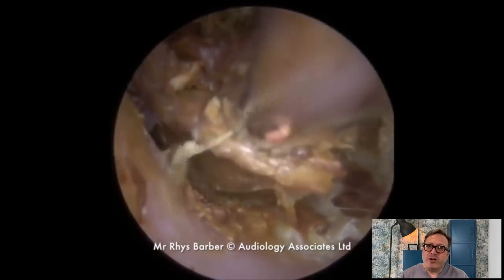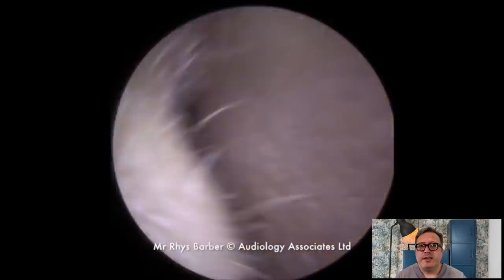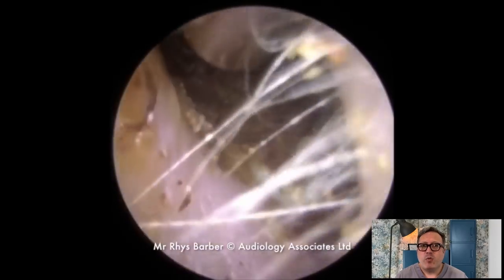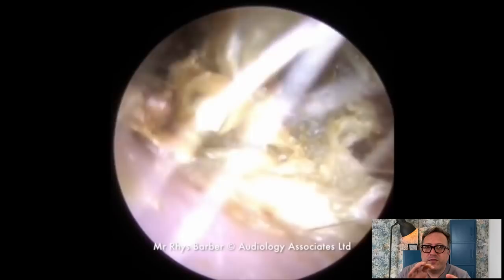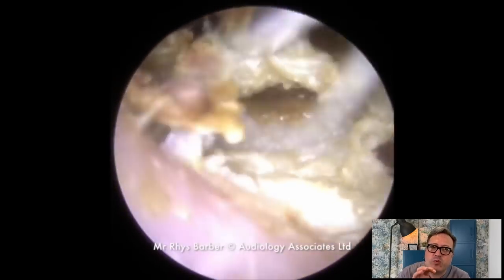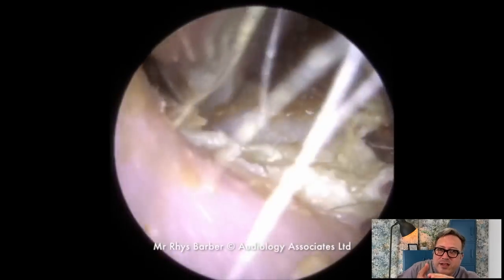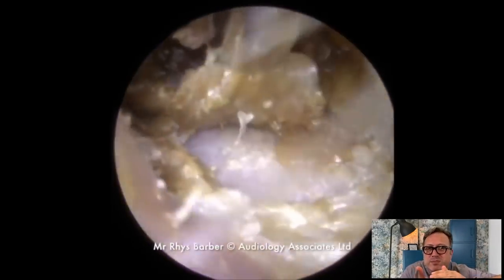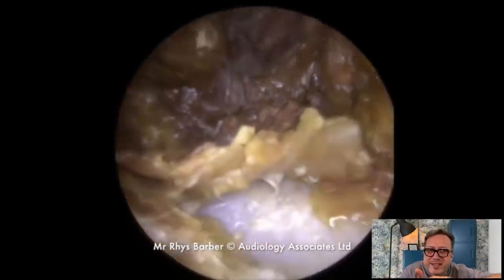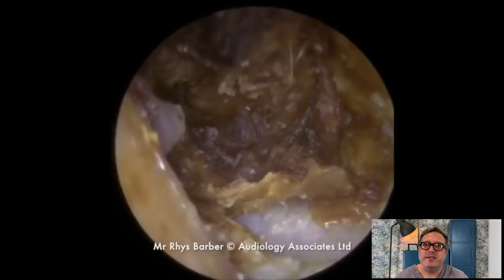That's what's basically collected together in this blockage here. See how this is pulling? As you pull it, you can see it just unravel from inside. It's like taking away a jigsaw puzzle — you're looking for that linchpin piece that when you take it away, the whole thing starts to come away. Look at the layers as we lift. Can you see how the layers of dead skin have contributed towards this blockage? Look at the whiteness underneath there — that's the next layer that's died off, ready to bundle together into this ball.